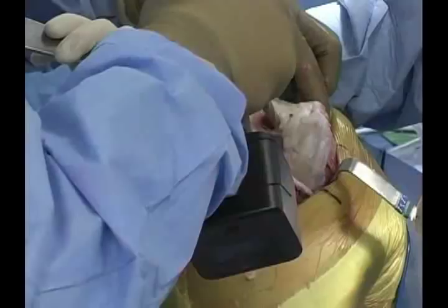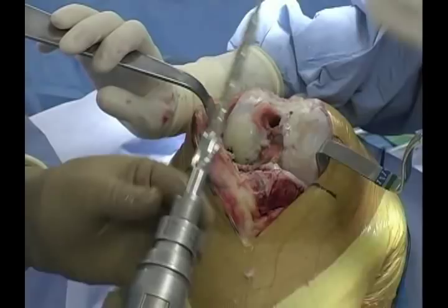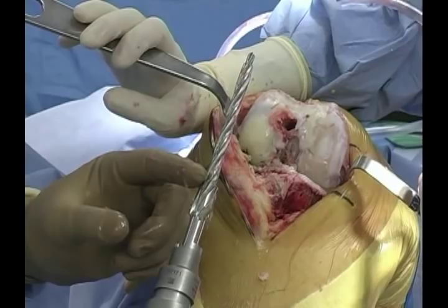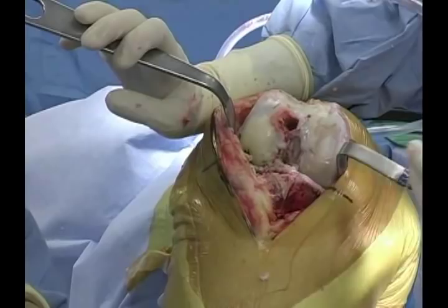The first step with the balance technique can be either a tibial resection or a distal femoral resection. One key point is that the drill has a depth stop and a larger diameter for the measured resection technique. Because of the IM rod that goes into the canal with the balance technique, you only want to drill to the smaller diameter — you don't want to go beyond to the larger section, otherwise the rod will toggle in the hole.